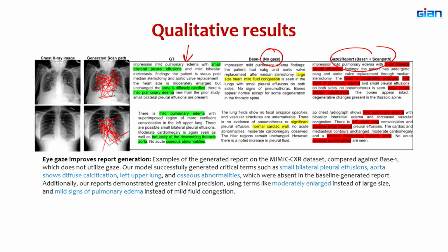And I'll provide you the slides. You'll see how the different terms that you see here in the gaze report match a lot better with the ground truth as compared to the model that does not have gaze in it.